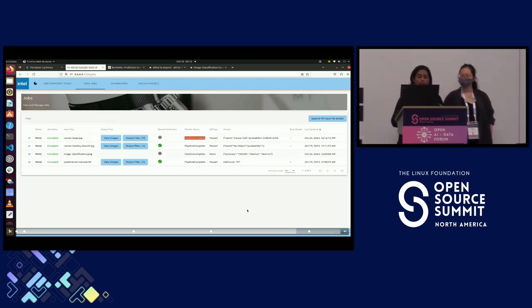It's a JSON string. It's saying that it's detected some cancer cells there, and the probability is 46%. This model training was done just for the demo sake, so we're not aiming for any accuracies here.